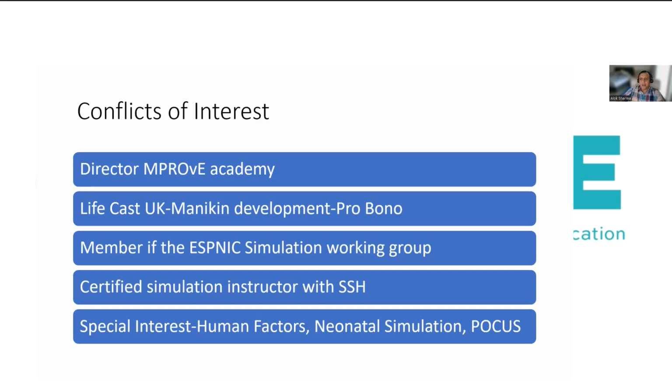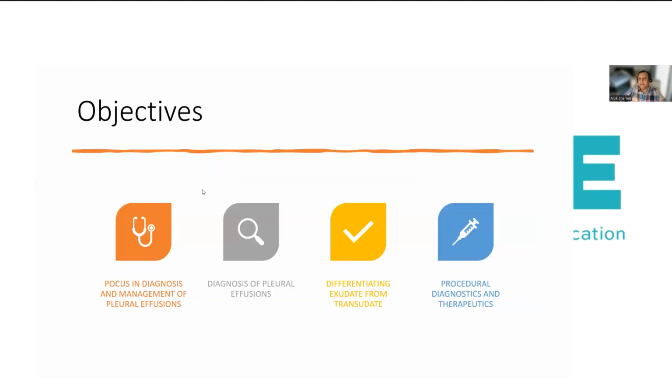Now, what I'm going to talk to you about today is the use of point-of-care ultrasound in the diagnosis and management of pleural effusions. This is a topic that's quite close to my heart because, as you know, the management of pleural effusions often involves us needing to do procedures which involve either tapping or drainage of the pleural effusion through the passage of chest drains.